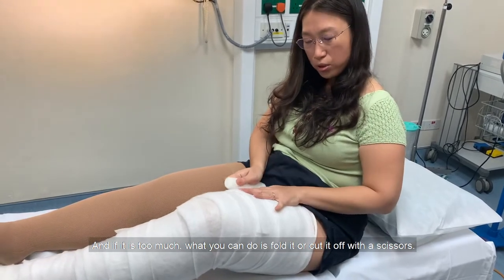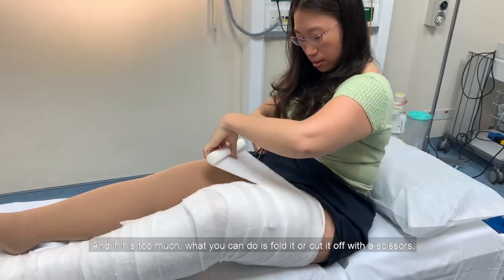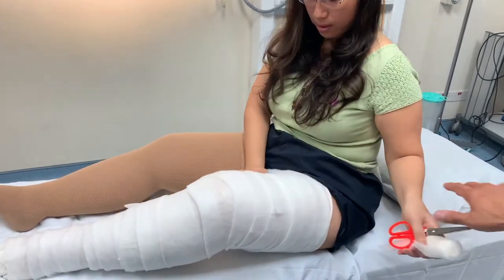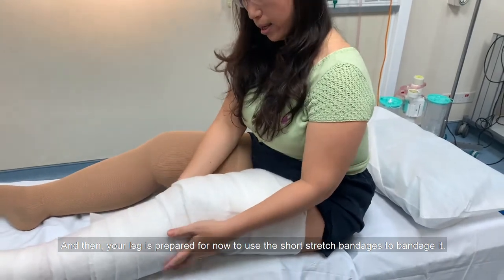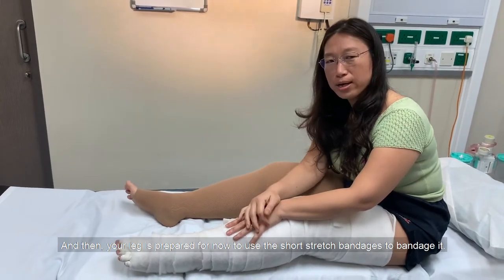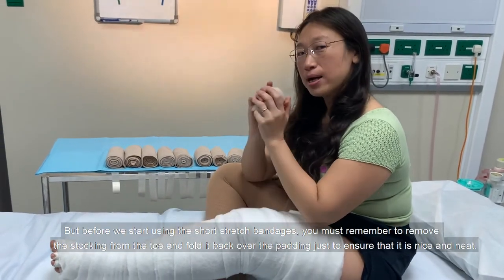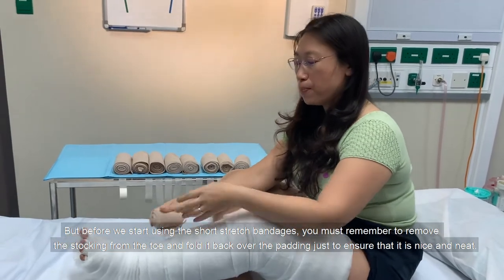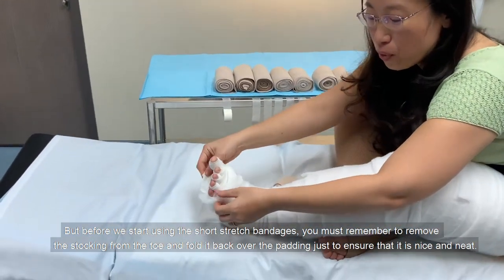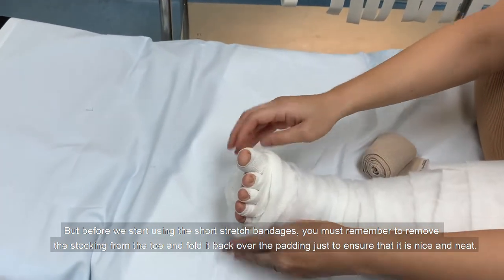If there's too much padding, you can just pull it and cut it off with scissors. Your leg is now prepared to use the short stretch bandages. Before you start, remember to remove the little stocking piece from your toe and fold it back over the padding just to ensure it's nice and neat.